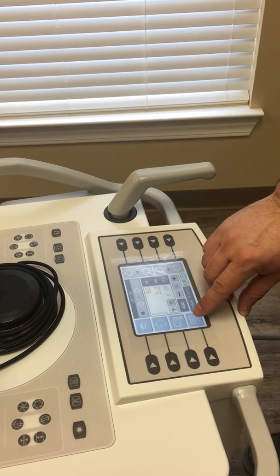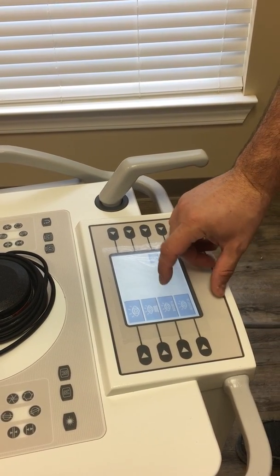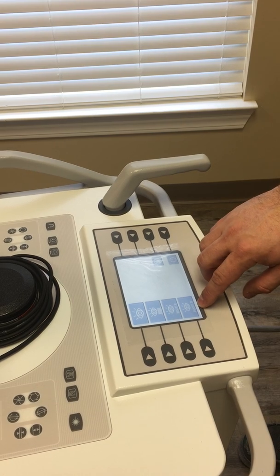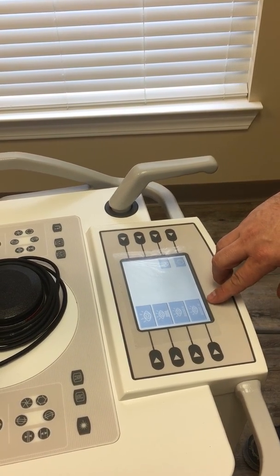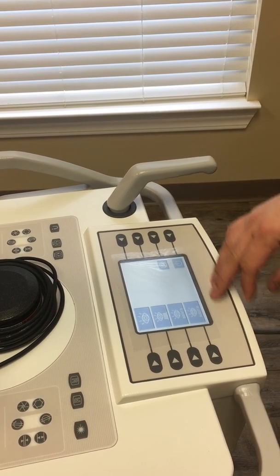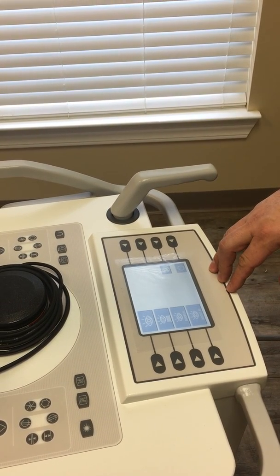All right, so back to the mode screen here. That's normal fluoro. This is pulse fluoro. This is boost 8, so that just shoots at 8 MA fixed, but the KV is adjustable. And this is boost 20, so it shoots at 20 MA fixed with adjustable KV. Boost 20 is going to put out a heck of a lot of dose. On this particular unit, when I checked it, I have paperwork in my bag, it's about 19 R per minute. So it's like double the dose of normal fluoro maxed out.